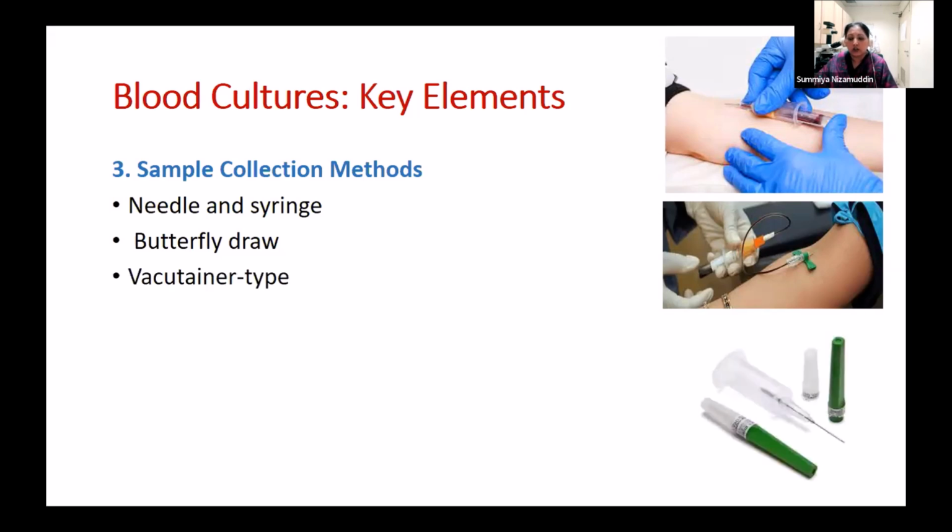You could also use vacutainers to draw blood culture samples. Now vacutainers actually come in handy अगर आप patient के बहुत सारे blood samples draw करने वाले हैं. So if the patient has UCE or CBC or LFT के भी samples draw करने वाले हैं, that's why vacutainers come in handy. And it's always better कि सबसे पहले आप blood culture का sample draw करें and then you move on to your other samples. Okay.